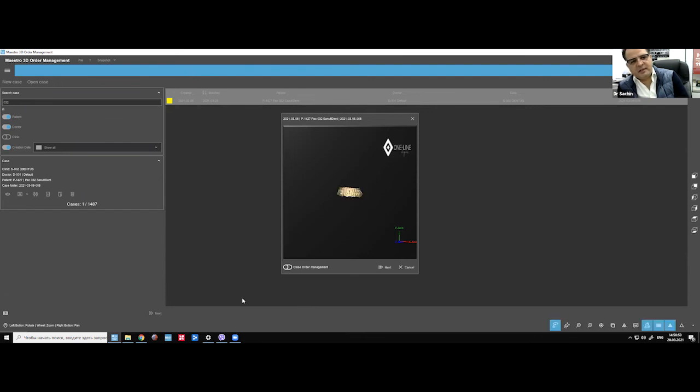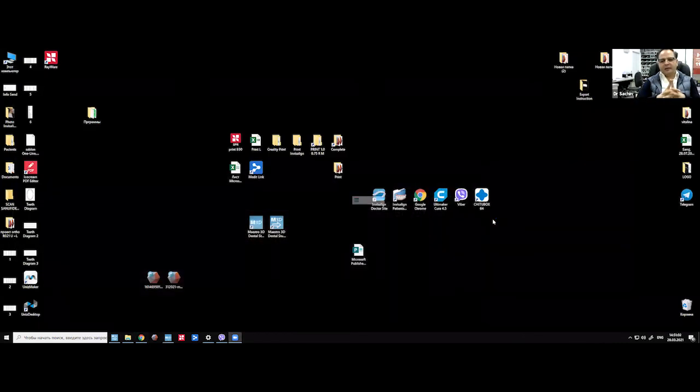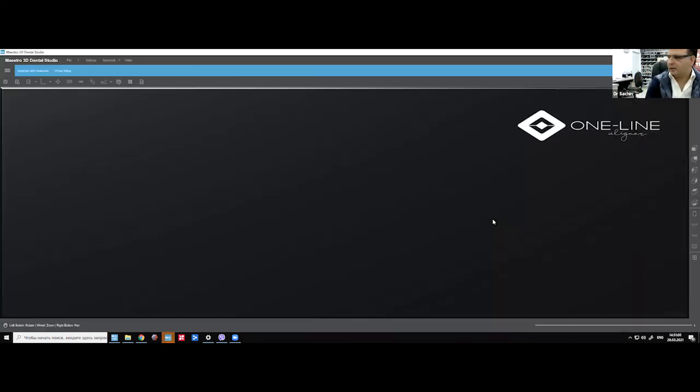So we changed the attachments so that you don't need to put hooks on the teeth anymore. So I'll just share it with everybody what change we did with the attachment to get those.